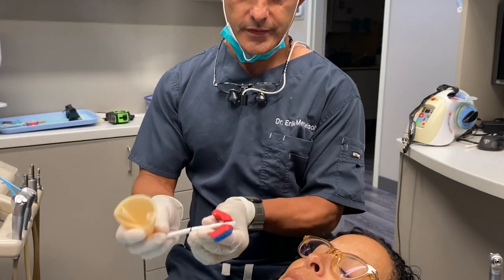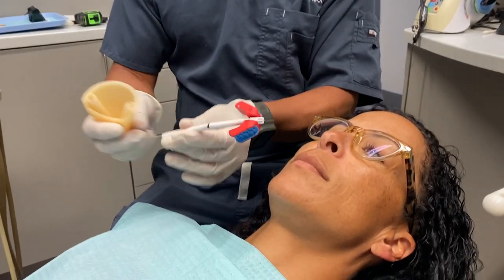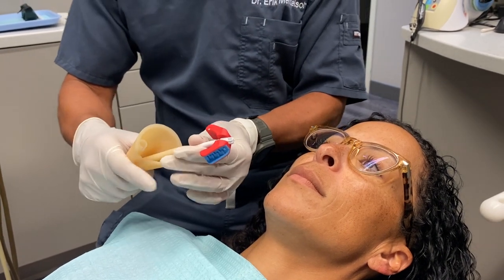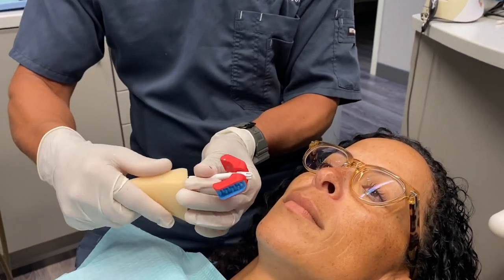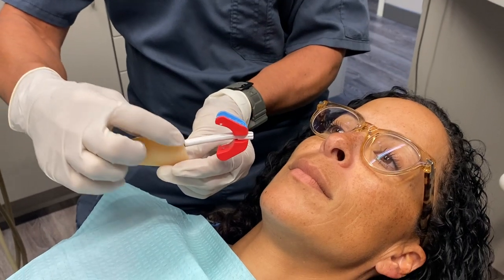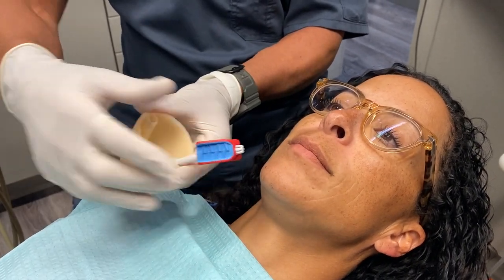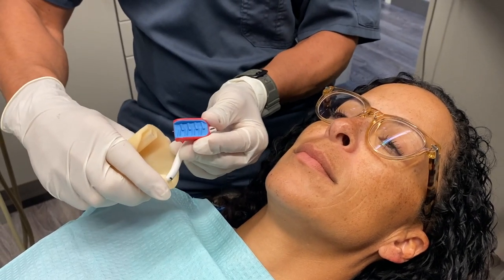So that pops in, then I put the saliva ejector inside the Solovac port and we're going to get it so the two and a half goes to the outside ledge. I'm going to take our bite block and bend it towards the midline.